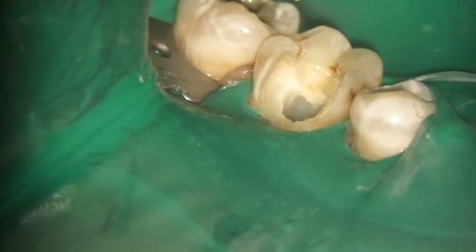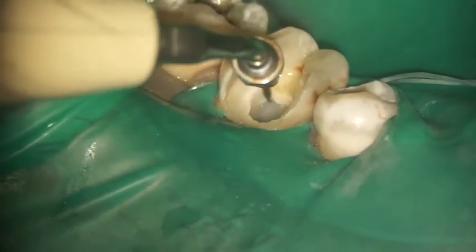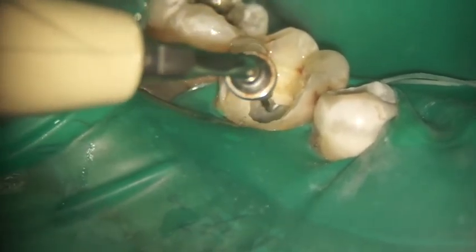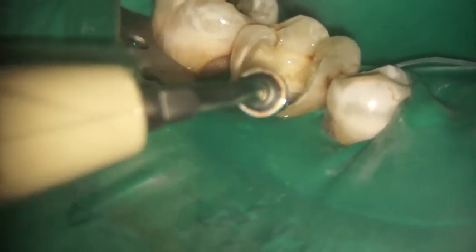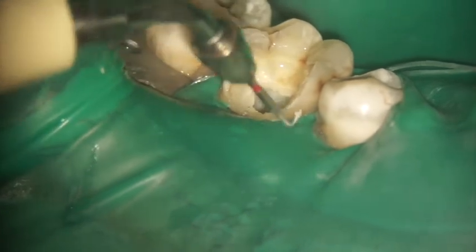If it is not cleaned properly, there is a high chance of failure, and if it is not filled sufficiently, there is a high chance of compromised strength for the particular tooth. So it is supposed to be cleaned sufficiently and filled properly. For this purpose, we have a special instrument, that is our U file. Here what I have used is a modified U file. The modified U file allows us to clean these pulp horns and constricted areas of the pulp chamber.